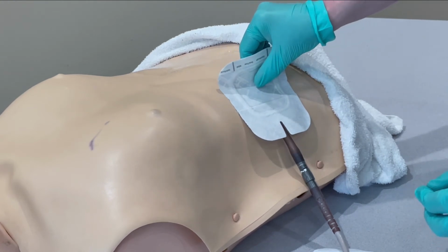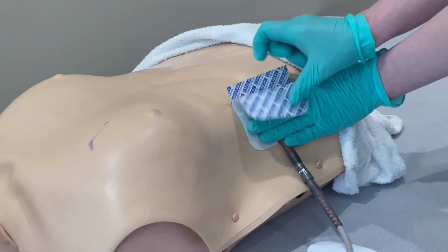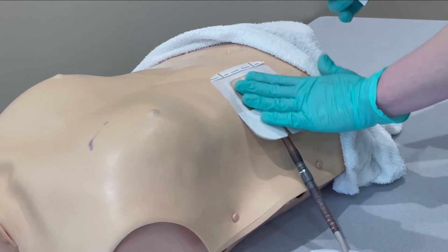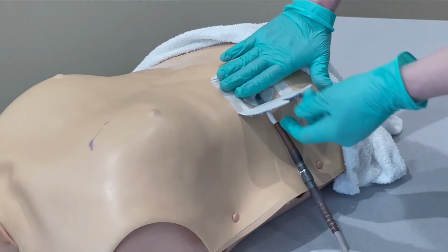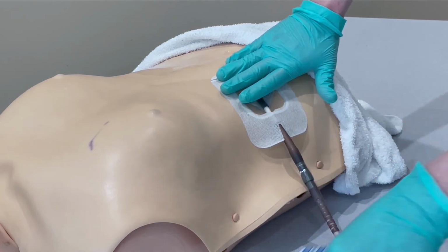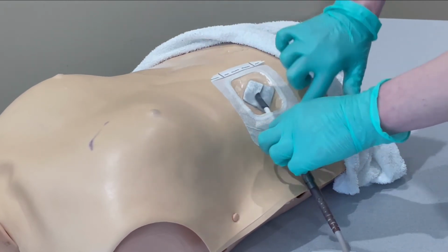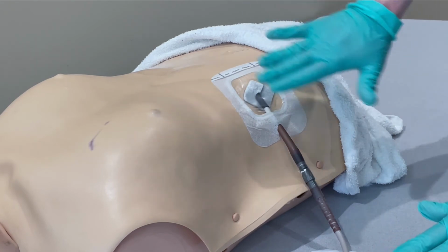You're gonna place this with the paper side down, and using your hand, you're gonna anchor the dressing and pull the paper. And this is what's gonna allow the paper to fall off and the sticky part to touch onto your family member's skin. Then you're gonna go ahead and do the same thing on the other side. Now this is gonna fall off. You can go ahead and adhere that down and make sure that it is an enclosed circle, and with the disc right in the middle of that window so we can see it.